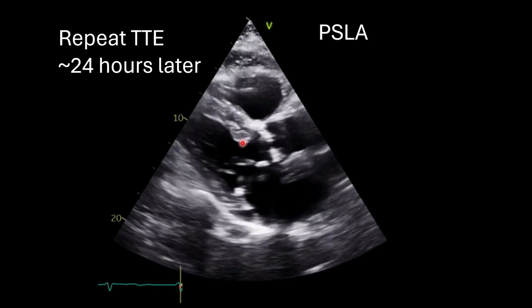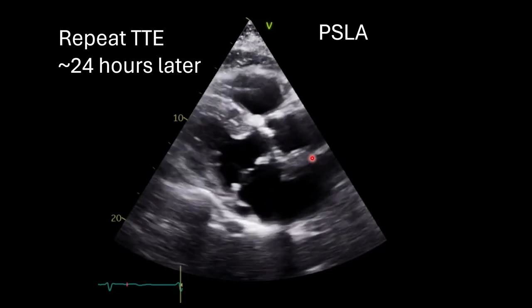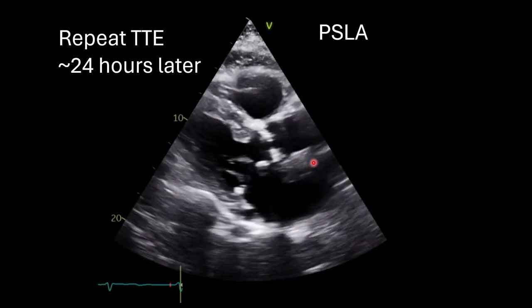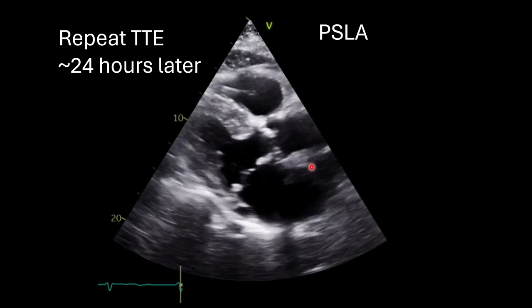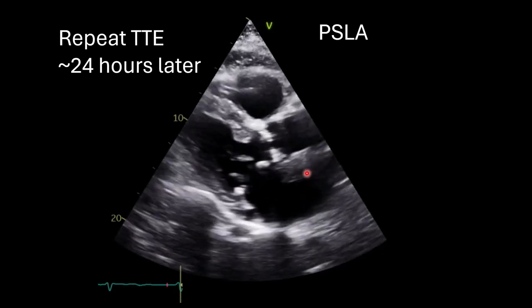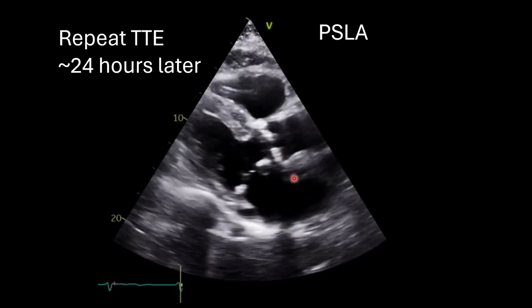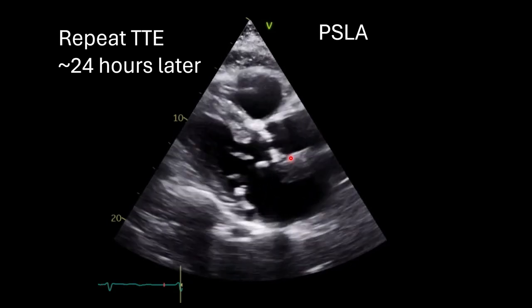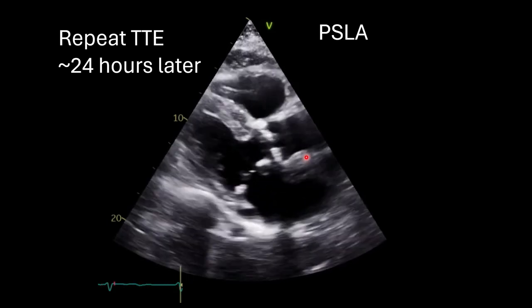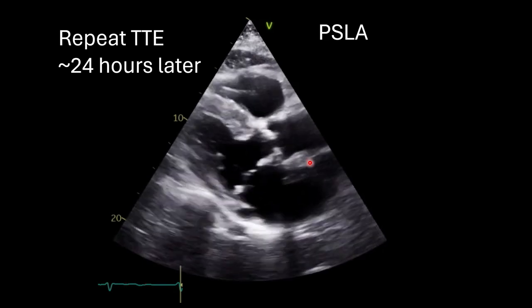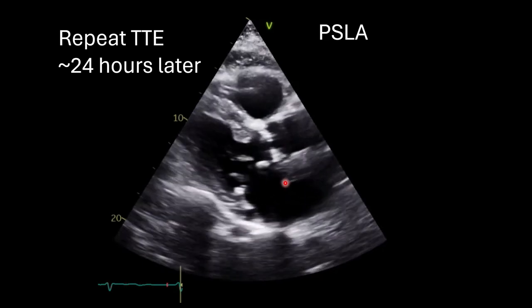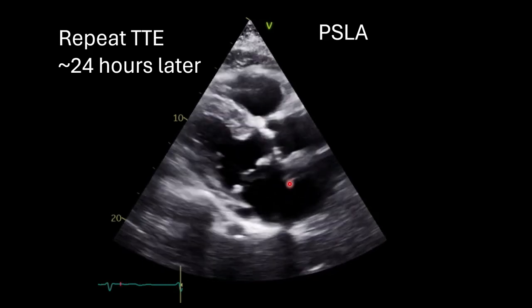After about 24 hours, there's a repeat echocardiogram. On this parasternal long axis view, there's now an echogenic mass that appears to be piercing the interatrial septum and is now in the left atrium.